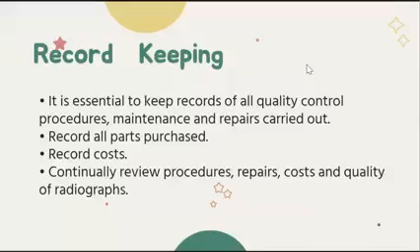Okay, by maintaining and using your processor correctly, there will be less downtime, less inconvenience, and lower cost. So if you take care of your machine properly, of course, the flow of your work or workflow goes straight through. And it increases throughput or the efficiency and the job satisfaction. Of course, the rad techs will be happy because there is not much hassle, no? No extra workload for them, no? Of course, if your machine has downtime, there will be extra work for the rad tech.